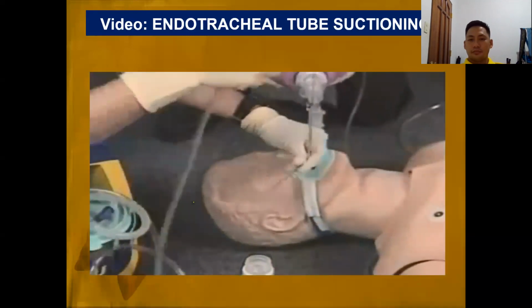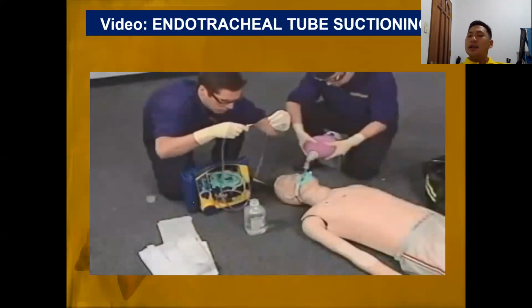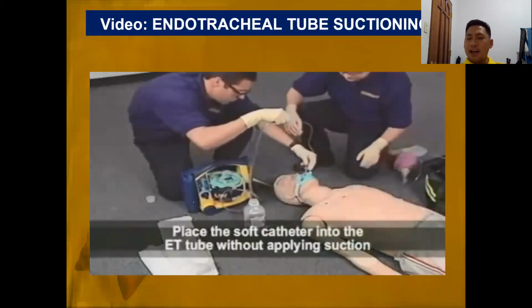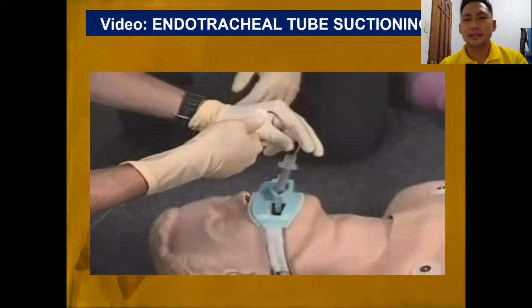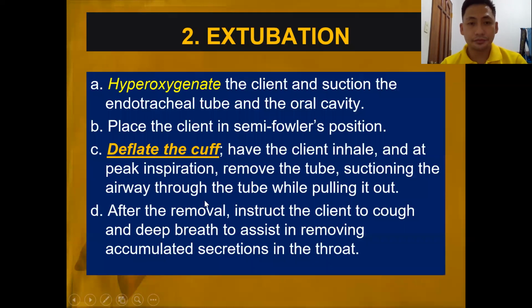Keep the catheter sterile during measurement. Actually, when you insert it and you meet an obstruction, you have already touched the carina, so withdraw a little before you start suctioning. Okay? So anyway, we will practice that during your return demonstration.